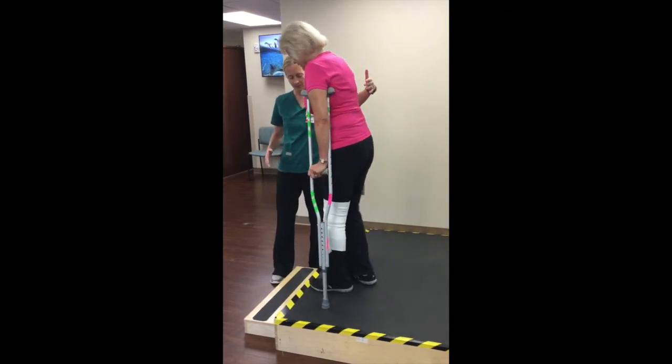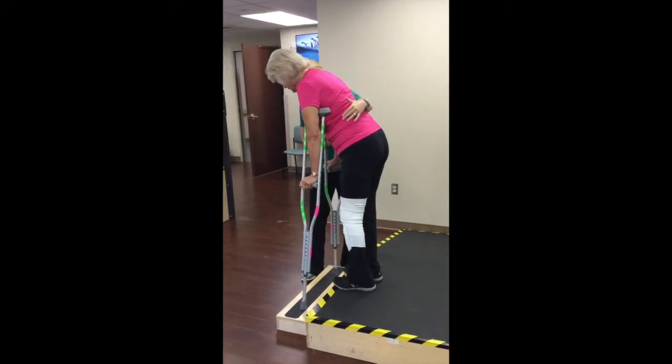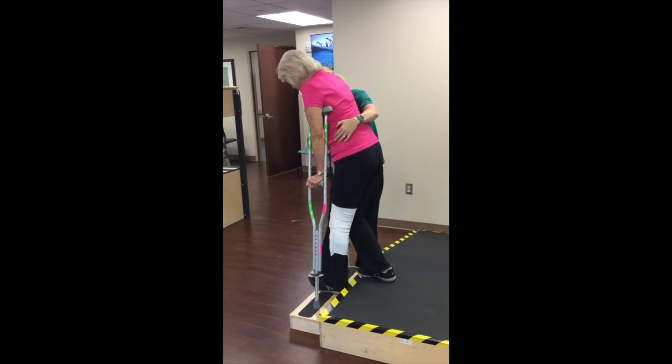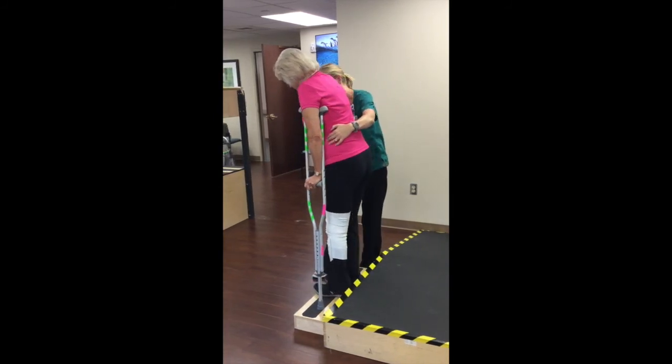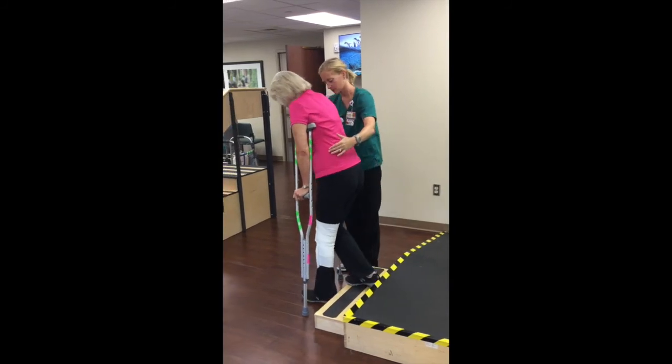To descend two steps, walk close to the edge of the top step. Lower your crutches into the first step. Step down into the first step with your bad leg, then step down into the first step with your good leg. Continue by lowering your crutches into the ground, leading with your bad leg then with your good leg.